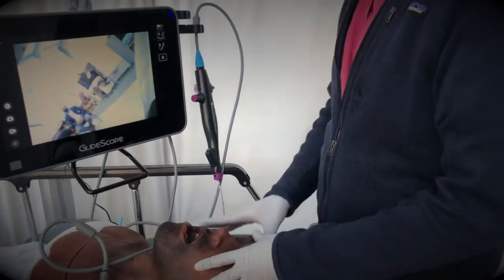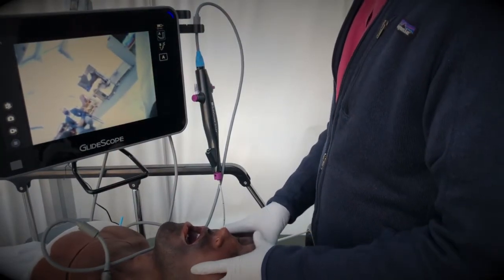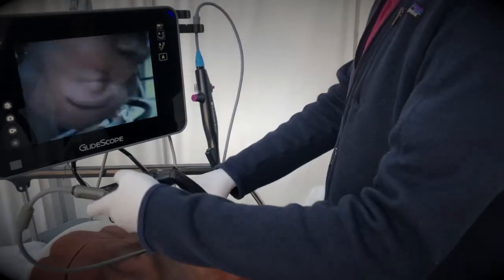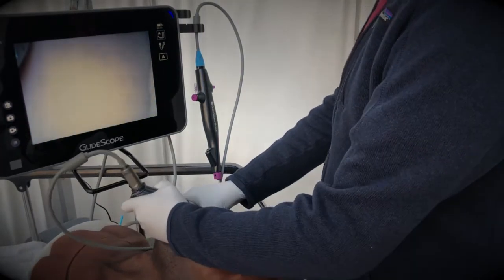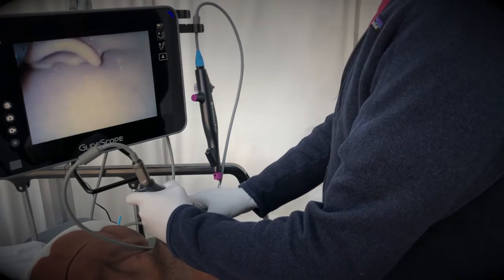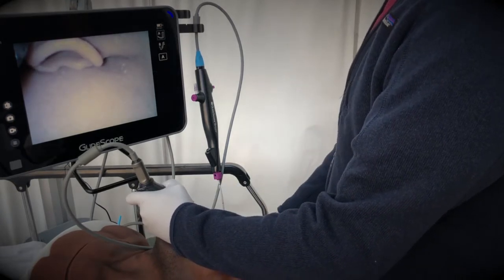Let's get started by dropping the bed all the way down to optimize our working conditions. Insert your standard geometry video laryngoscope blade and as you can see here the view is suboptimal, we only see the epiglottis.